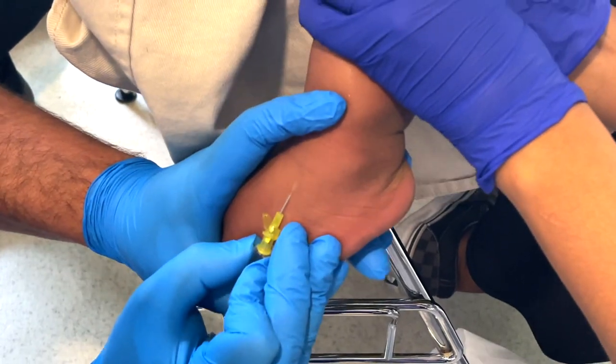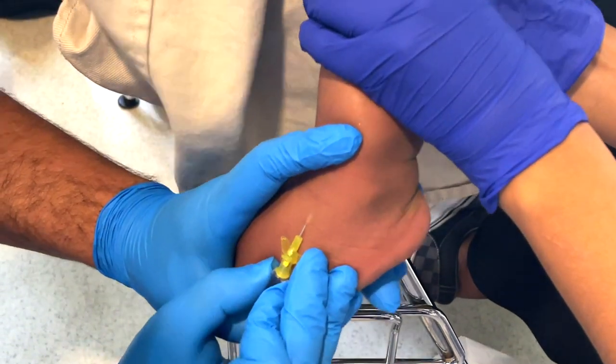Feet are an option but mainly for children who aren't mobilising. They're preferred less because they have a higher risk of complication and a higher fail rate, but sometimes it's really our best option. It depends on what the cannula is for — if you're using it for procedural sedation it's a quick in and out and feet are fine, but if the child is being admitted for antibiotics and walking around, having a cannula in their foot is really disruptive.